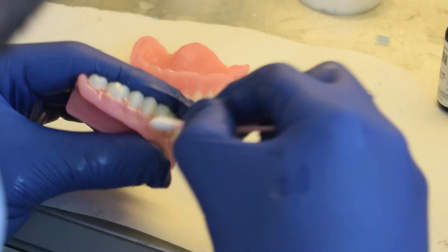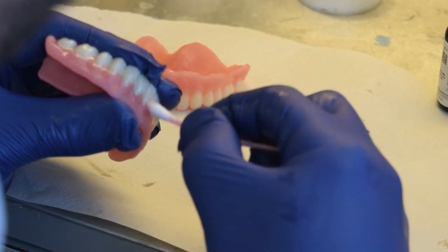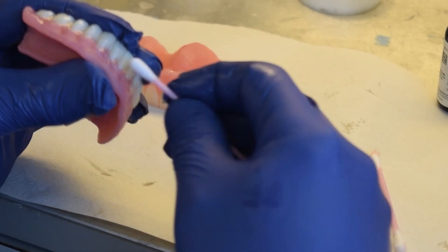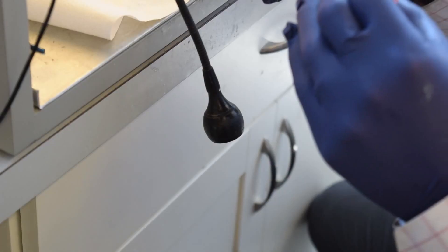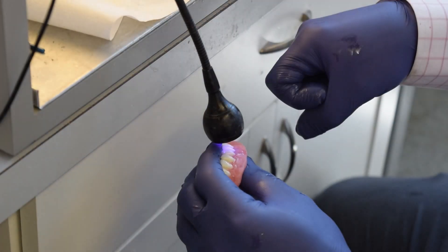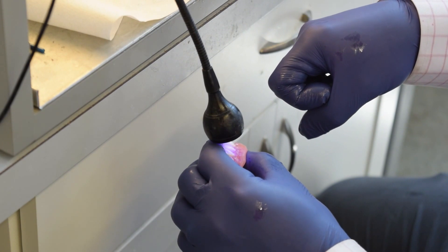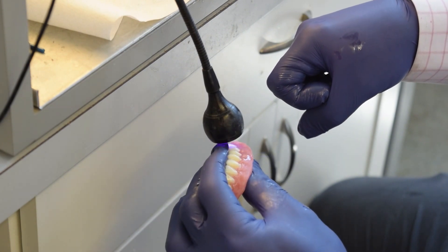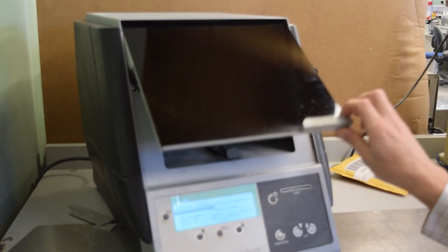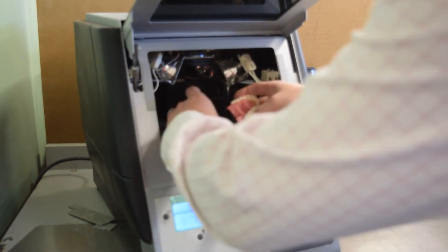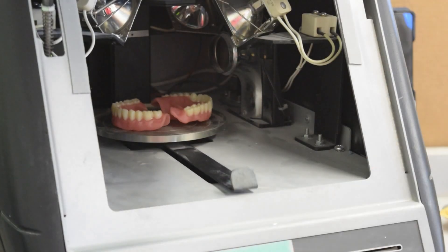First, the denture base is filled with the same Lusitone base resin and the 3D printed teeth are moved into place. Once inserted, additional amounts of denture resin is applied around the outside and soft cured with a UV lamp. This is done to tack the teeth in place before the final curing can begin.